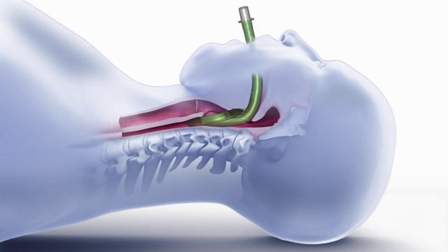Once inflated, the laryngeal mask airway will center itself in the mouth. If placed correctly, oxygen will flow through the lumen of the device and into the trachea.